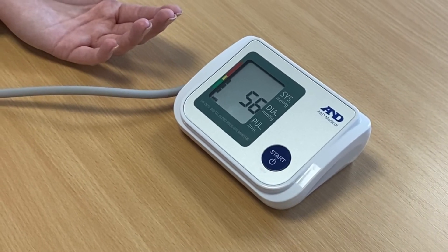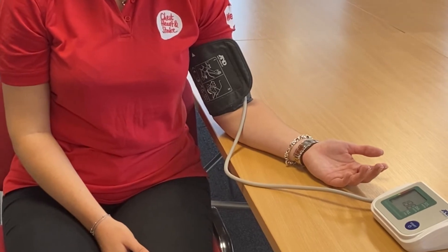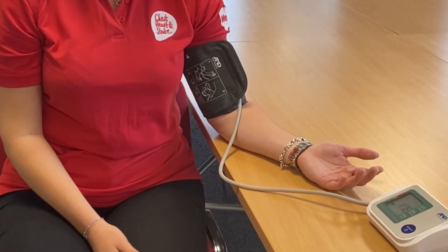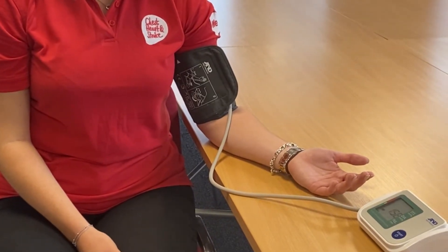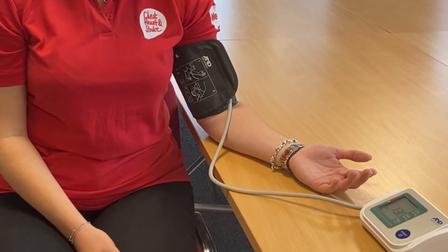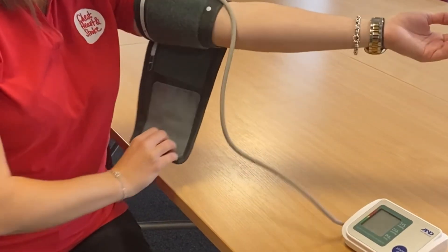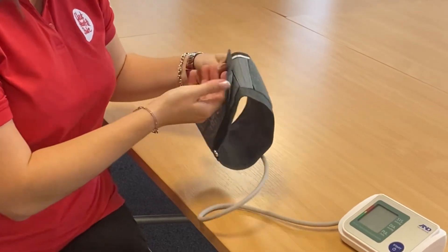The pressure in the cuff is then slowly released, and during this time the monitor uses sensors to detect vibrations in your arteries. The pressure in the cuff is recorded at two points as the blood flow starts to return to your arm. These measurements are used to give your blood pressure reading. Once the monitor has fully released the pressure and provided a result, remove the cuff from your arm.